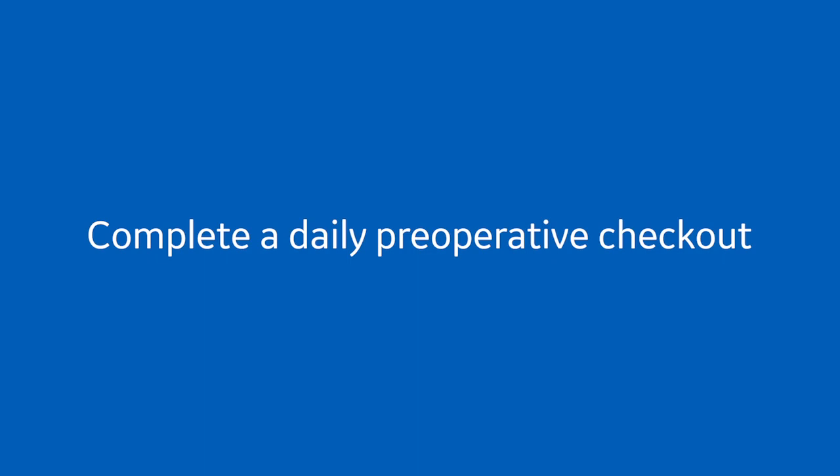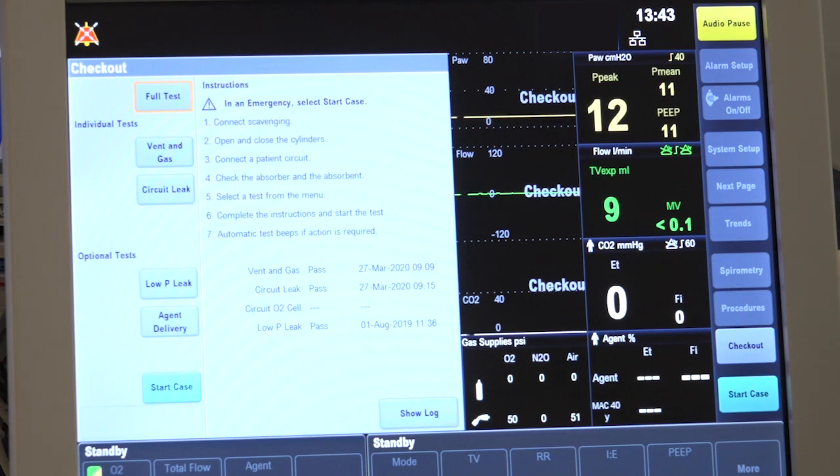Complete a daily peri-op checkout as described in the user's manual. The anesthesia machine is intended to be power cycled and fully tested once a day. All accessories that will be used during the case should be attached to the circuit to ensure accurate circuit compliance.